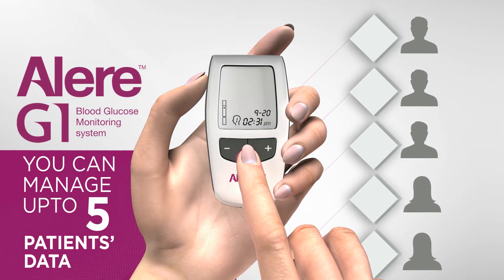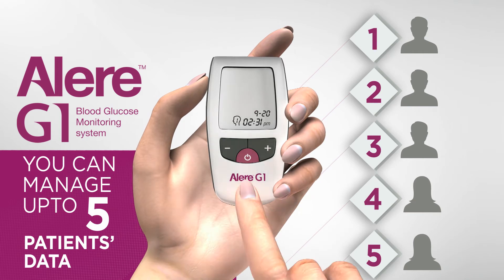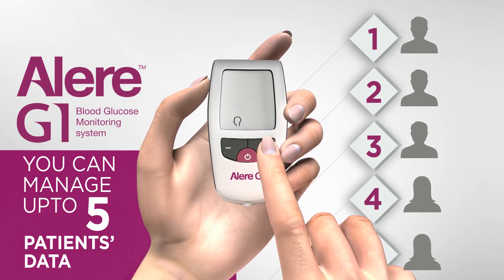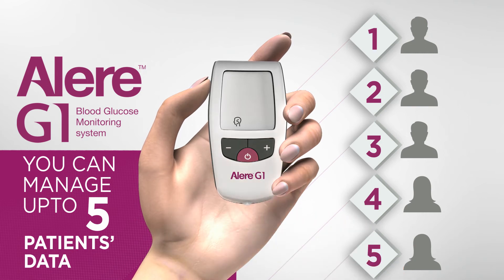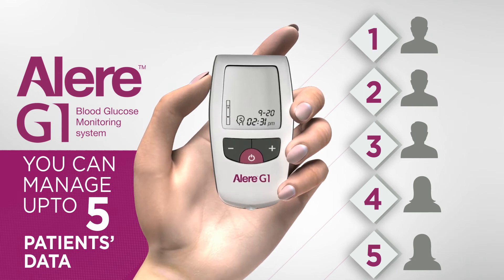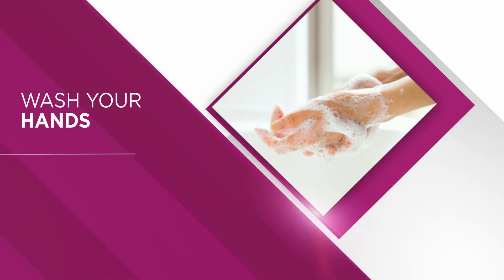The Alere G1 glucometer can manage up to five users' results separately and create different user IDs for all of them for identification. If there are multiple users for your glucometer, make sure you select the correct user ID before you proceed to take the test. Now your device is set for testing. Before your test, don't forget to wash your hands in warm water.